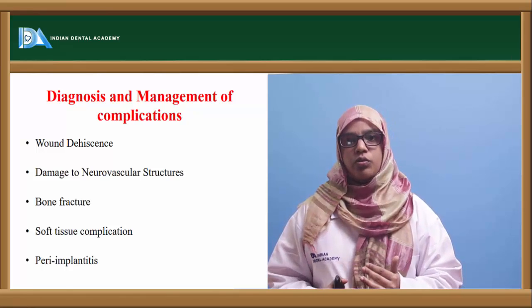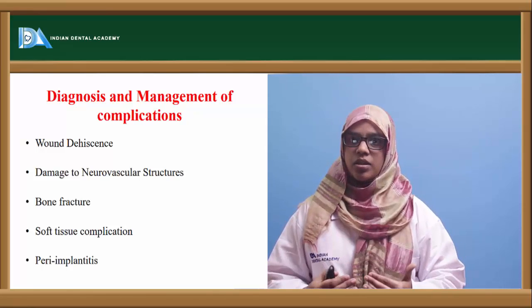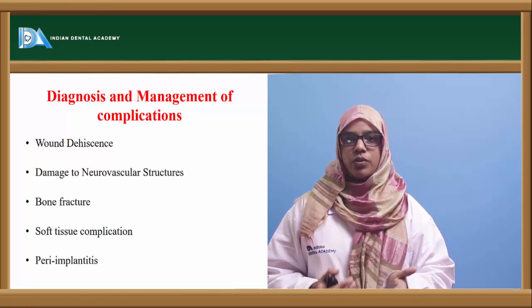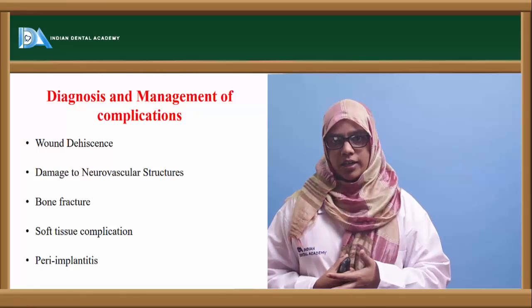Ask the patient to maintain oral hygiene, keep the area clean, and use a lot of mouthwash. Once 3 months are over, recall the patient, remove the cover screw and place a healing abutment. Damage to the neurovascular bundle can occur.